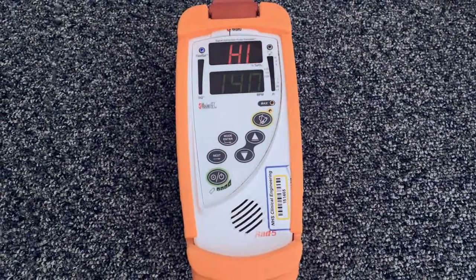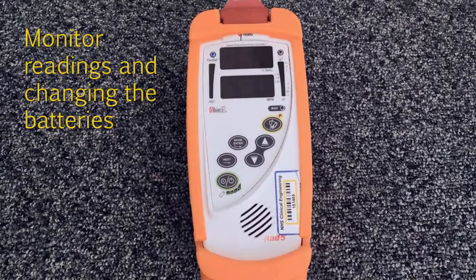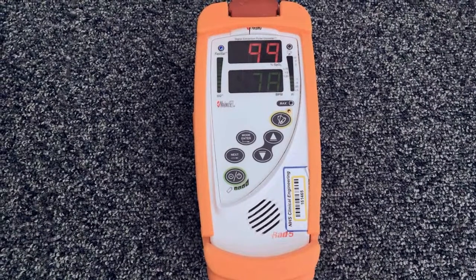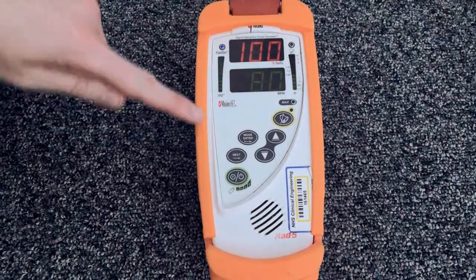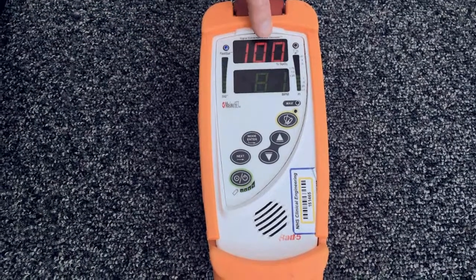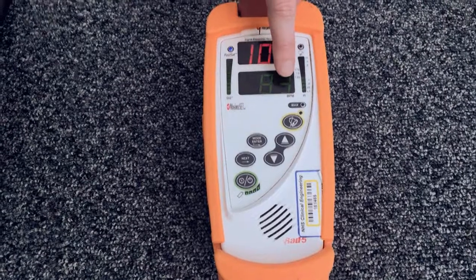Once the monitor is attached, let the machine load up. You will see the dashed line display appear. This shows that the machine is sensing your baby's heart rate and their oxygen saturations. When the display loads up and you see numbers, the top line shows you their oxygen saturations, and the bottom line shows you their heart rate.